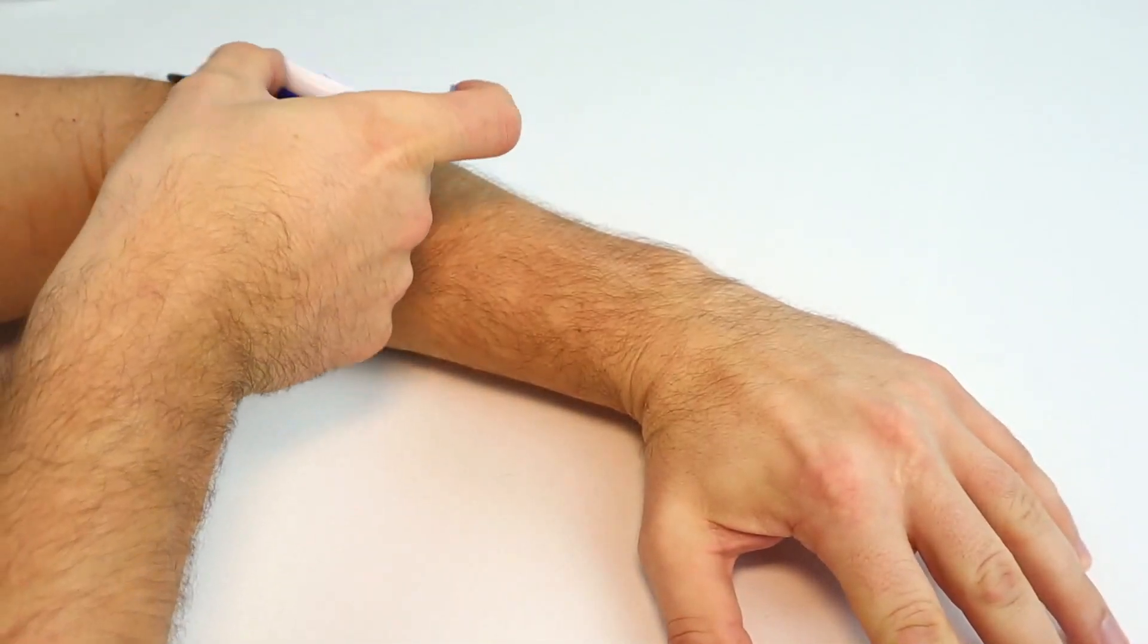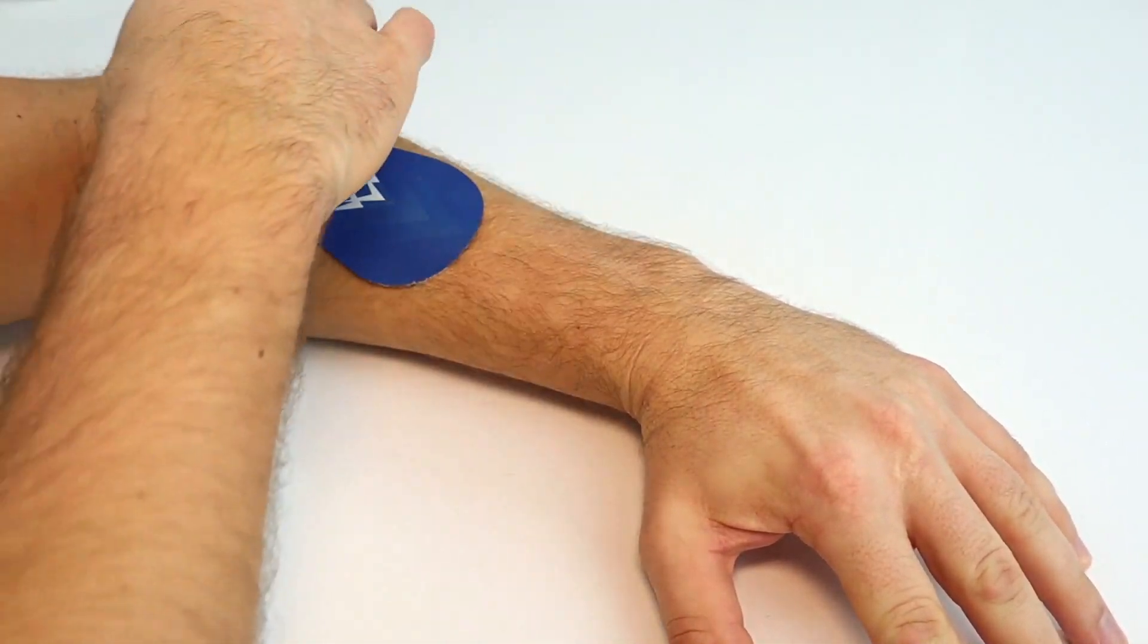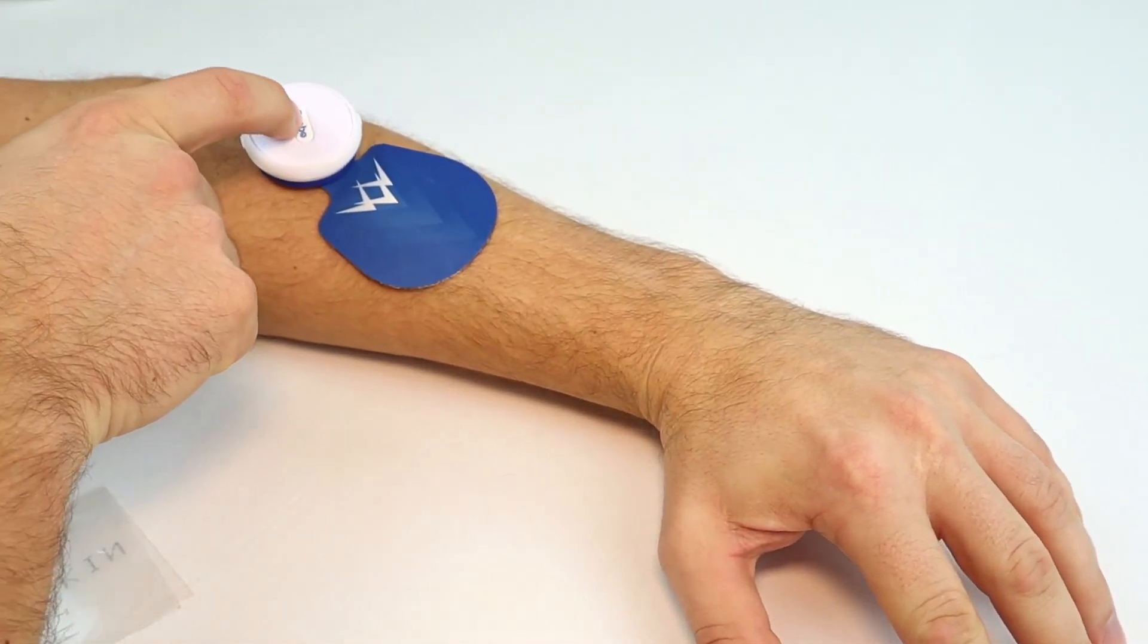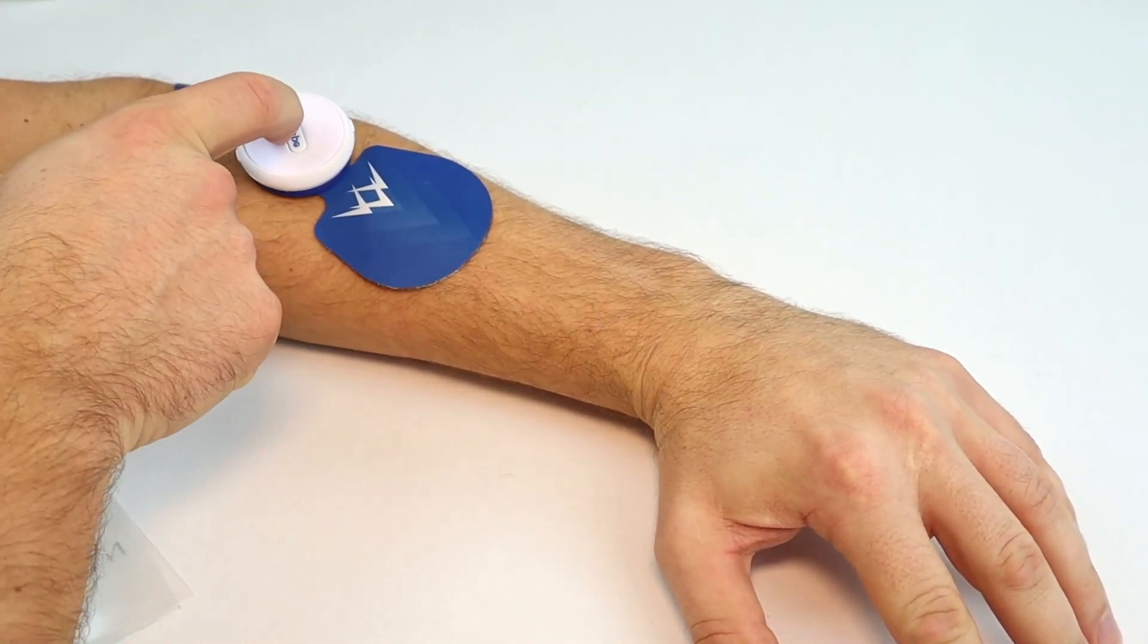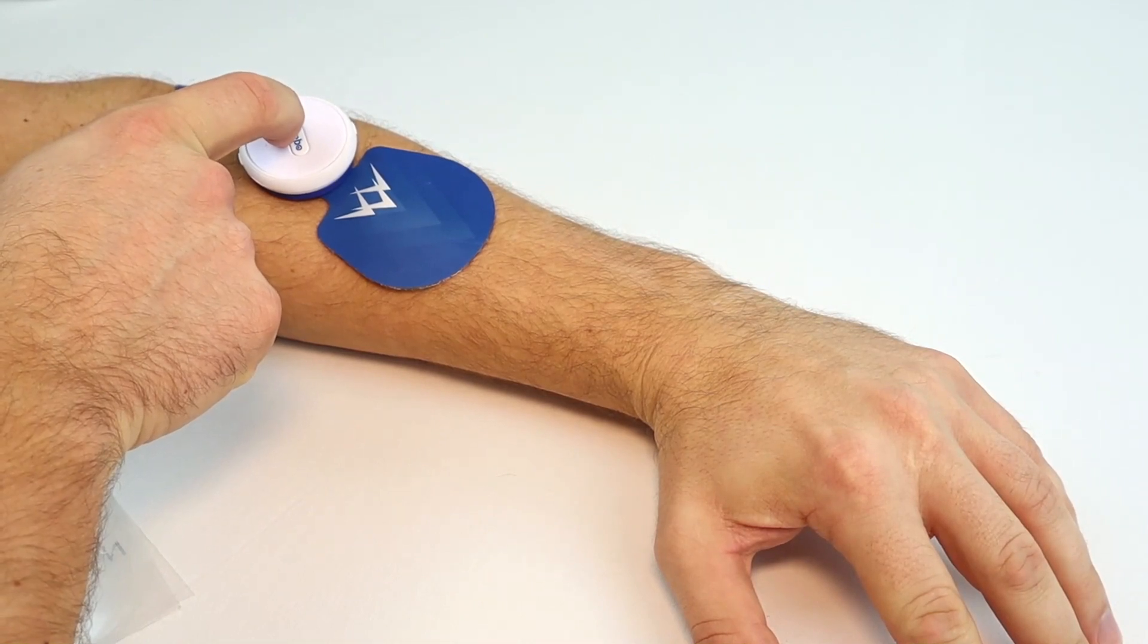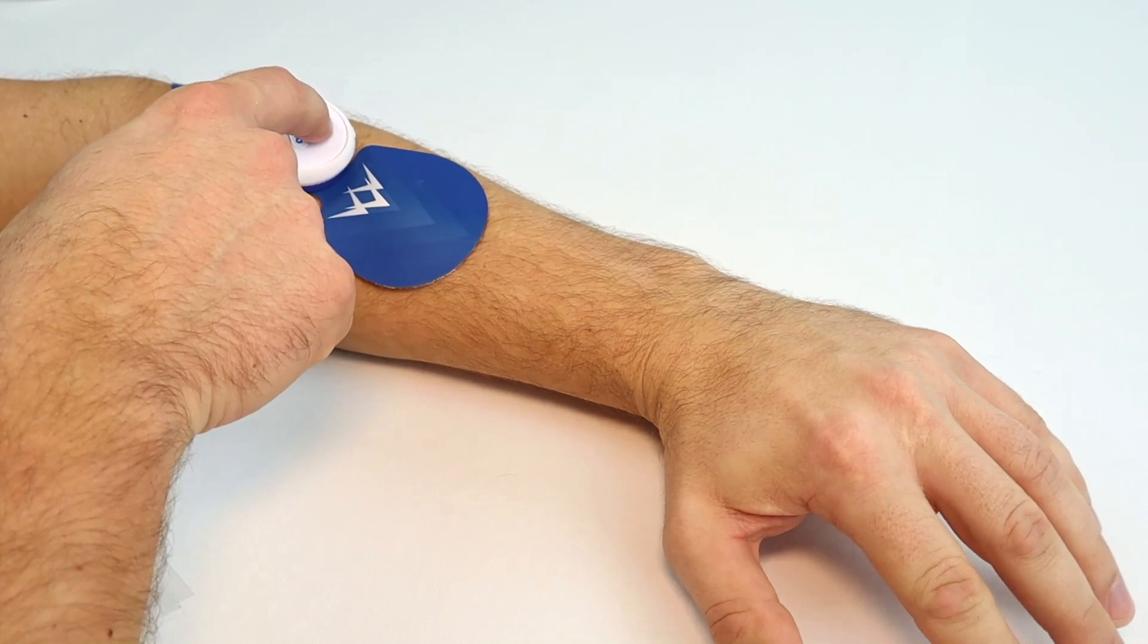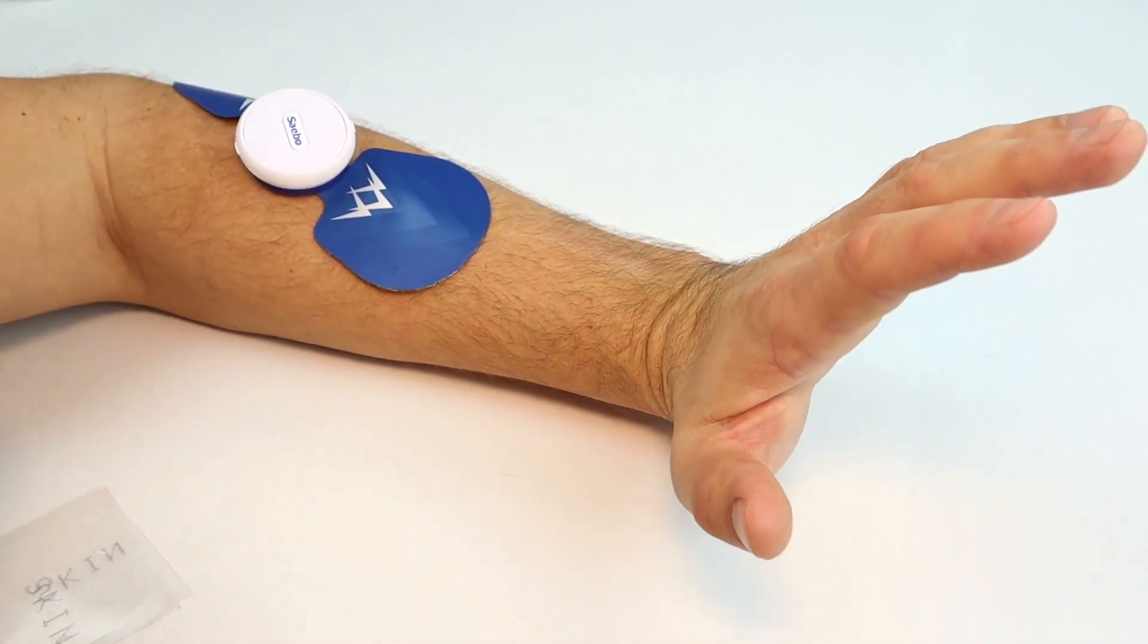Next, place it on a muscle group that you want to work. Currently I am putting it on the extensors of my hand. Hold the Saebo button down for three seconds until you hear a beep, and you can also see a blue light. Then push the button up, and you have electrical stimulation.